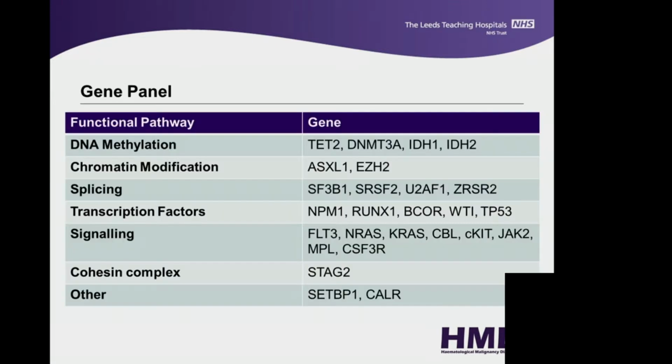You'll probably notice on there that there's a definite glaring omission. CEBPA is not on there. As was mentioned yesterday, CEBPA works very poorly on any amplicon-based system and probably needs hybrid capture to actually work successfully.